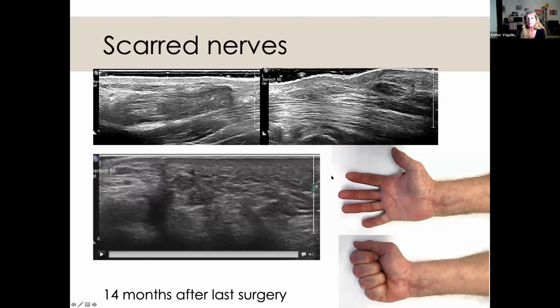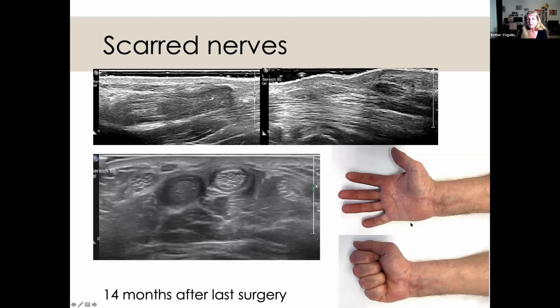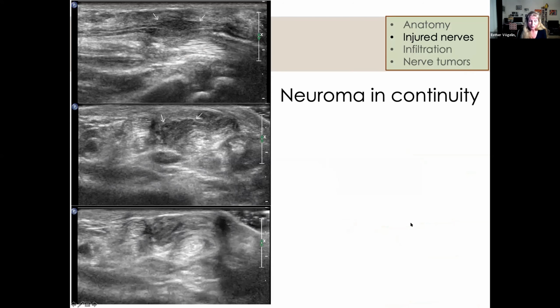And you see here the patient, without having sensation after this second nerve resection, is quite happy functional-wise. So I think I just want to show you that ultrasonography helps you to follow your clinics, what happens inside.